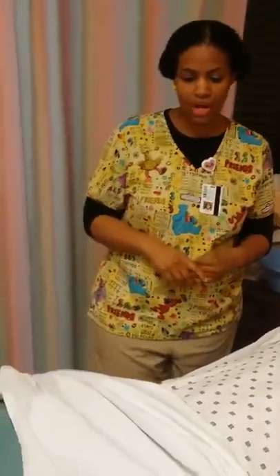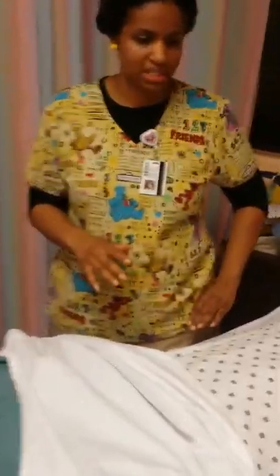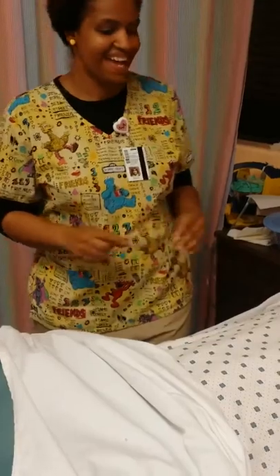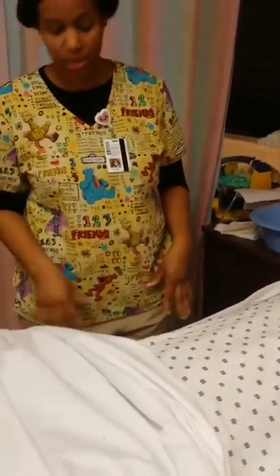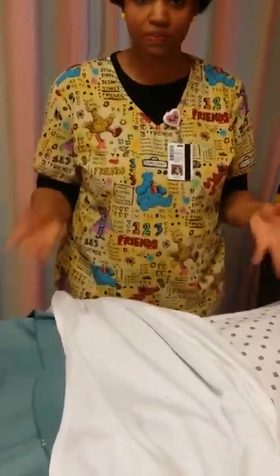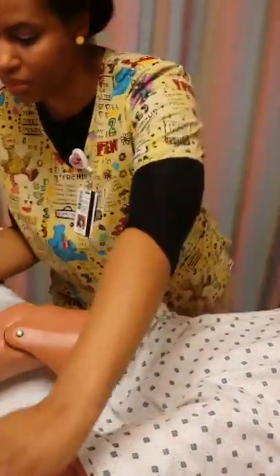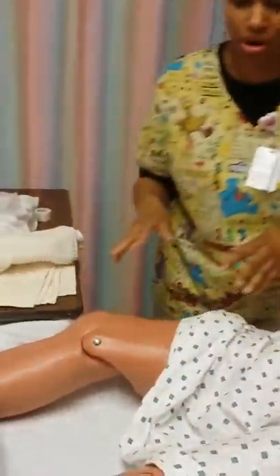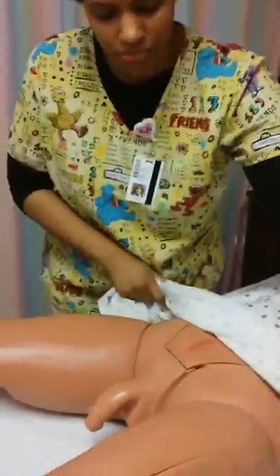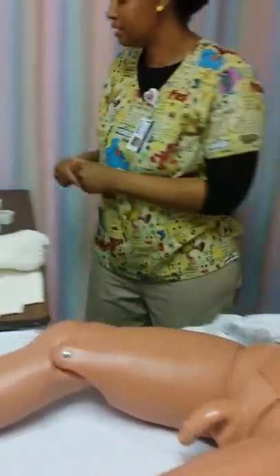Yes. Thank you. Okay, so first thing I want to do is make sure my bed is raised to waist level, which in simulation it is. And I put my railing down so I can reach my patient as well. My patient is positioned in a supine position, and I'm going to go ahead and uncover him, just enough so that the area is exposed but he still has a little privacy. There we go. And then I'm going to clean my hands again.